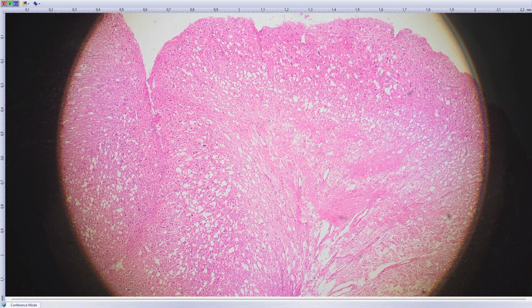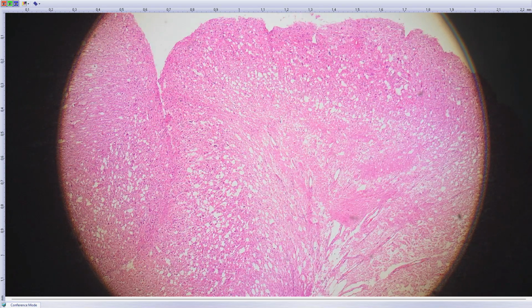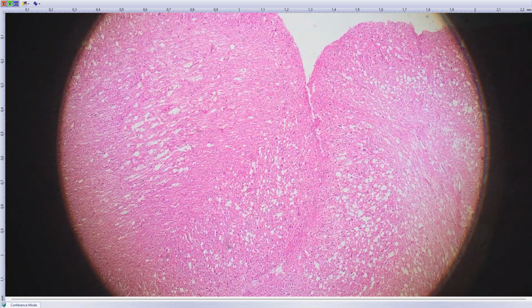And during the investigation, because of probable cervicobrachial syndrome, they performed some CT and MRI scans of the thoracic and neck region, and they incidentally found the tumor lesion in the posterior fossa, so in the cerebellum, and this is resection of the lesion.